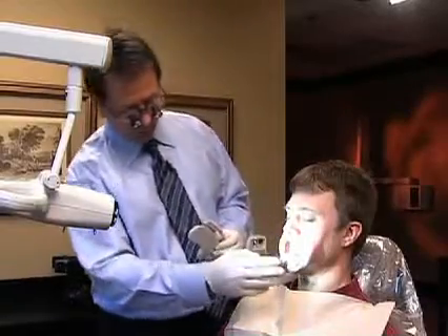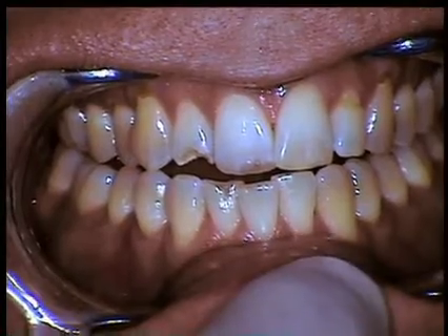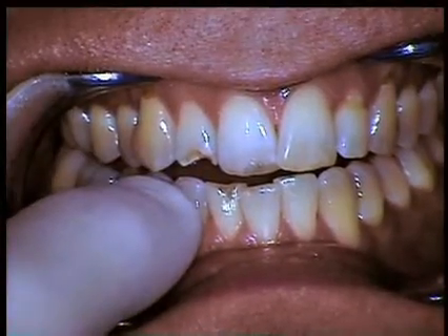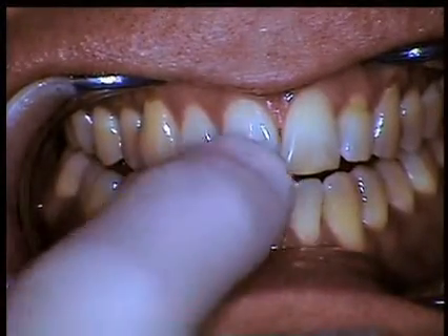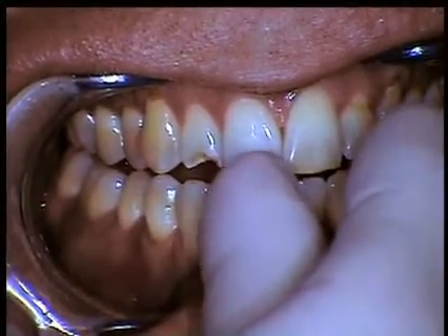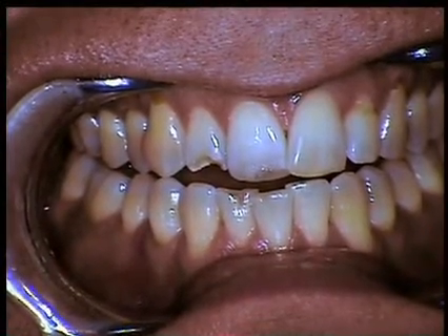As you can see, there are multi-colors in Daniel's tooth here. When we start studying the whole tooth and the anatomy, we look at the incisal edge on number eight as well as quite a bit of number seven that we're going to be replacing. We start looking from the gingival area up to the body — the mid portion of the tooth — and then also the incisal areas for translucency, surface anatomy, and other factors that can make or break the success of an anterior direct restoration.